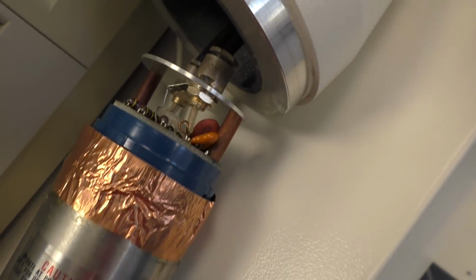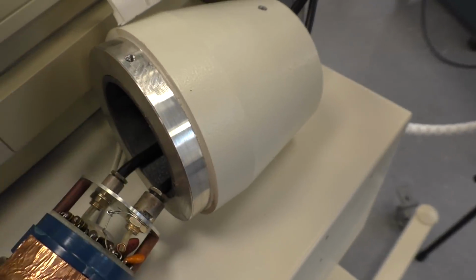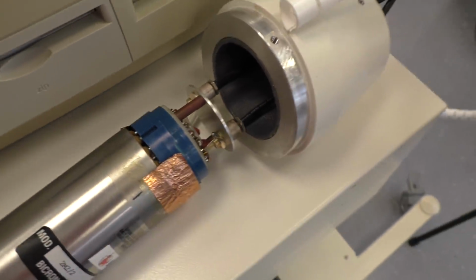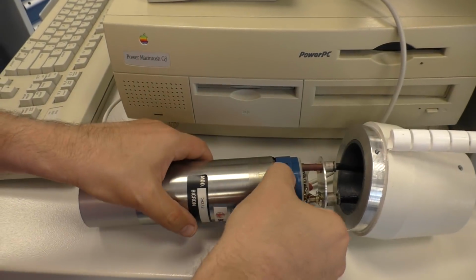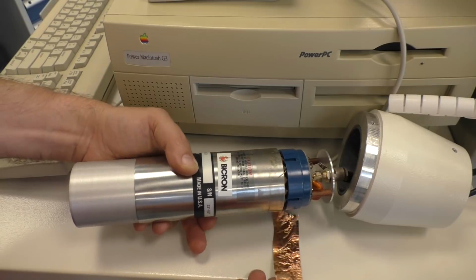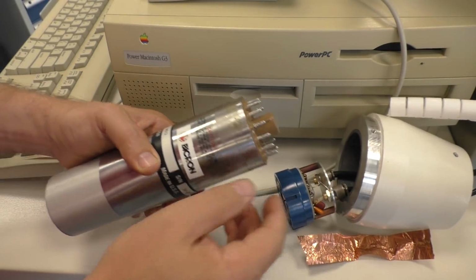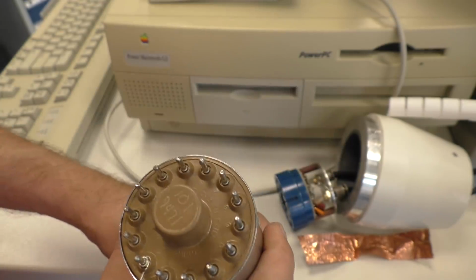Okay. There, the thicker wire here, that's the high voltage supply. They use a coaxial wire. And the thinner wire is the signal output. It looks like there is some kind of socket. Maybe we can unplug that. I need 2 hands for this. Okay, let's see, there is some tape around here that should probably provide some shield and keep it from falling apart. Yeah, that's easy to unplug. Okay, seems that's a ground wire here. They simply wrapped it around, so that's probably good enough.